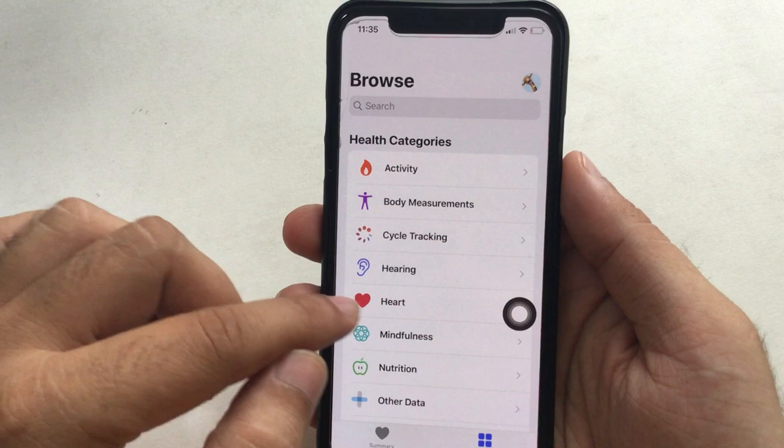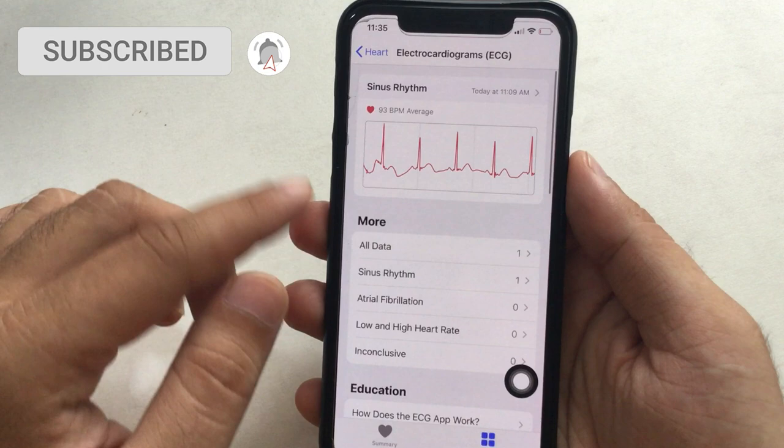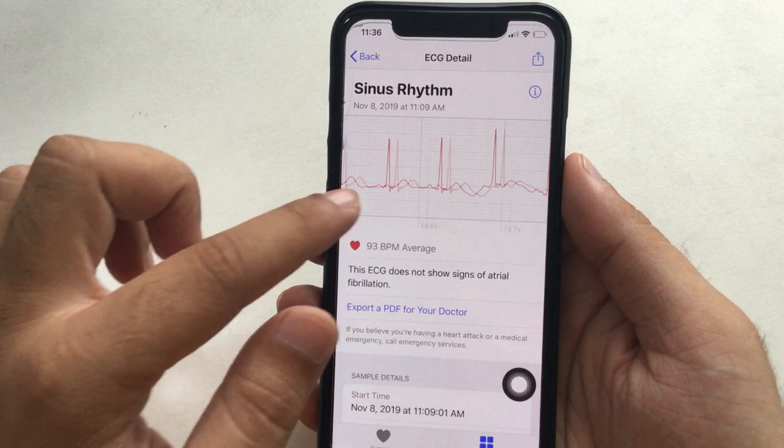Tap on the graph or swipe to the right to view the full recording. Here's the option to export PDF for your doctor. Otherwise, to print or share this sheet, tap on the sharing icon at the top right corner of the screen.